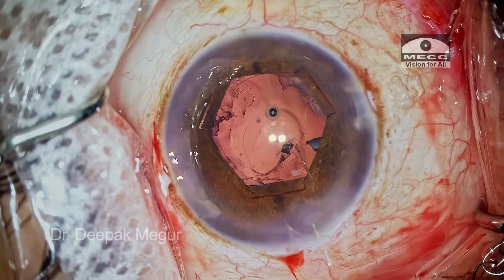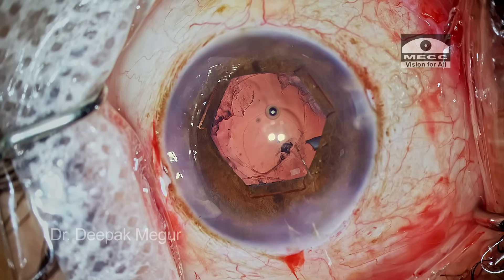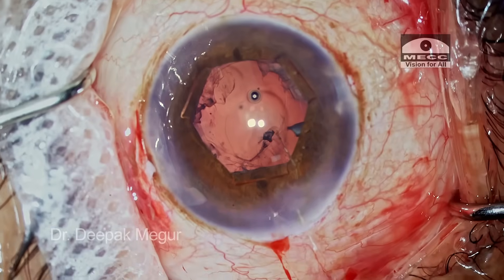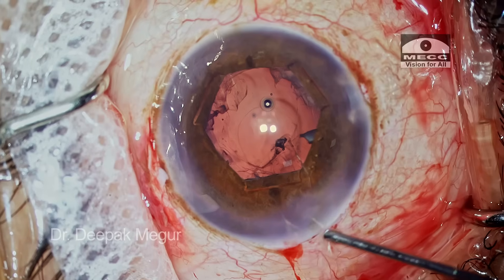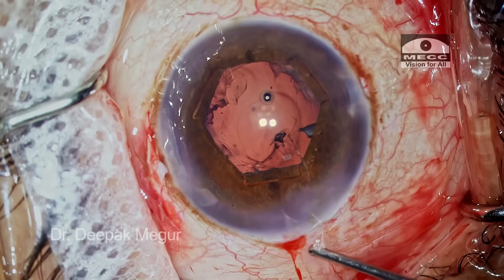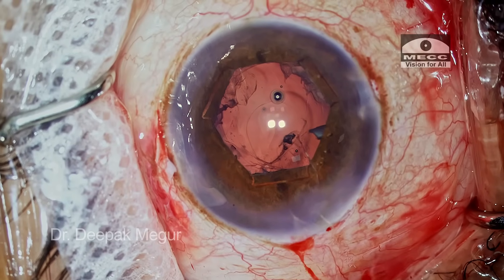They called for help and now I am in this OR to perform the anterior vitrectomy and place the lens. I always prefer to do a bimanual anterior vitrectomy with both probes in the respective side ports. Before introducing the vitrector through the incision, we always like to check the functioning of the vitrector by keeping the probe at the wound and checking whether it cuts or not. We don't want to be surprised by a non-functioning vitrector after entering the eye — better to check it at the wound itself.